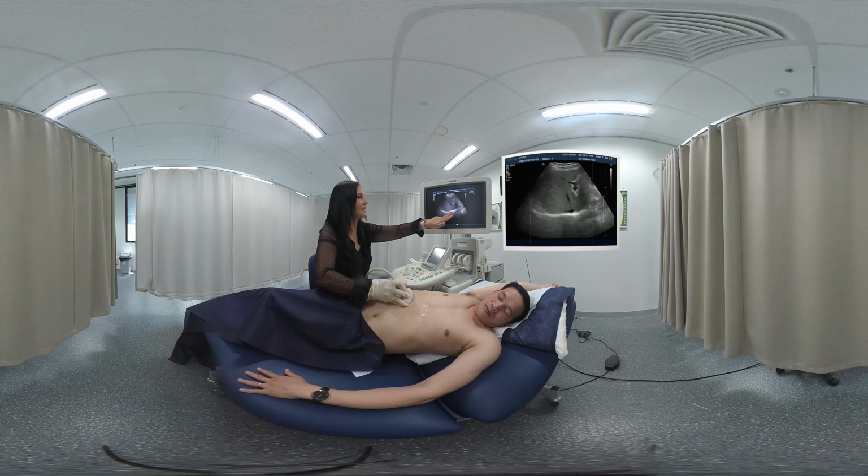Now, we'll just let the patient breathe away. That's it. And big breath in, hold your breath, that's it. Okay, so what we're seeing here is our left liver. We've got the IVC running underneath, as you can see there, and we've got our lobes. Now, this is our lateral segment, so this is superior, inferior, and now this is anterior and posterior.